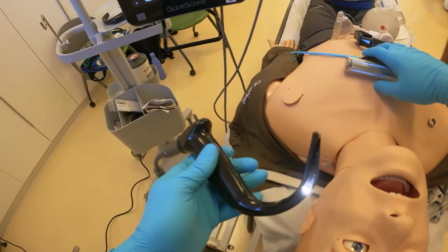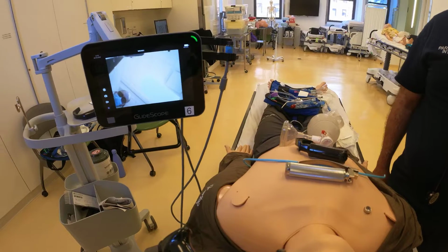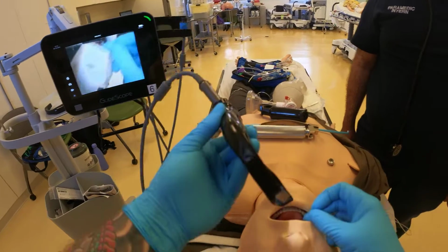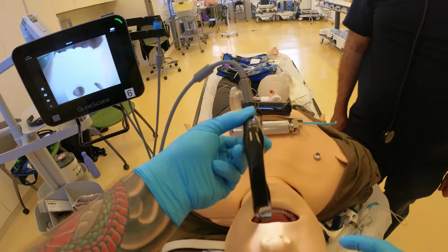And the other aspect is that we are also on video, so we see the video. So we're not directly looking in the mouth for our landmarks. We're observing the video screen to see it. So first, let me go through the landmarks so that I'll show you what I mean. So this blade is actually a finesse technique. You take your two fingers here, and then you take your thumb, and you come in.